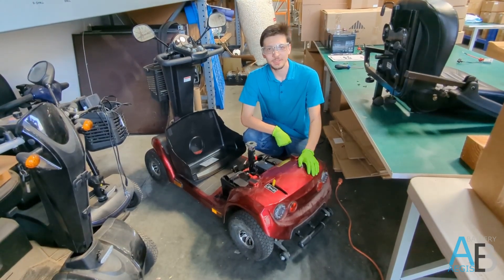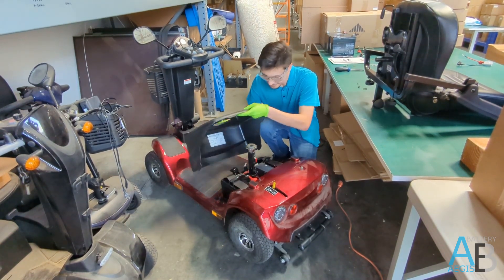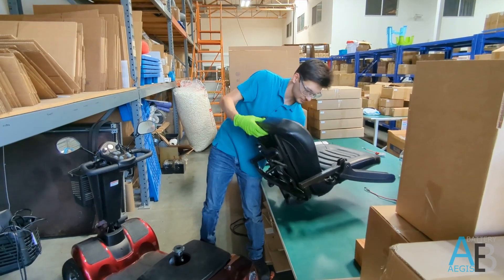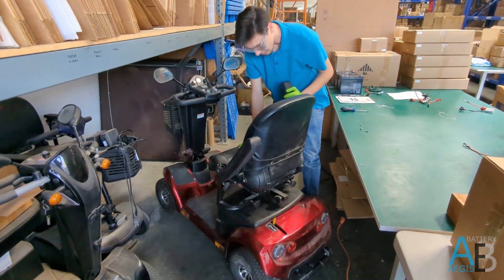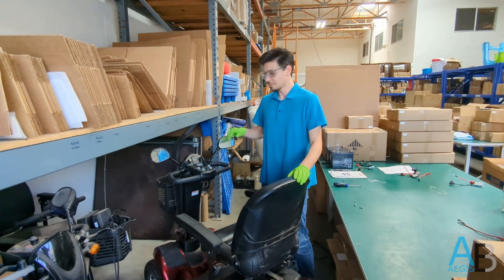Once we're certain the batteries are safe and secure, it's time to put the cover back on, and now the seat. Once that's done, you're ready to roll with your newly upgraded mobility scooter.